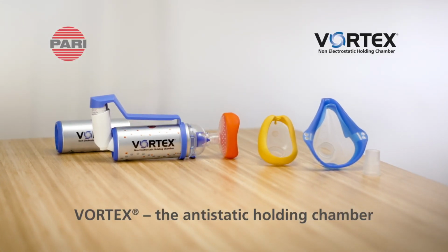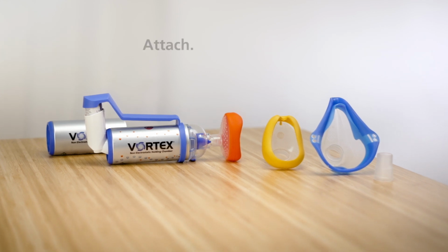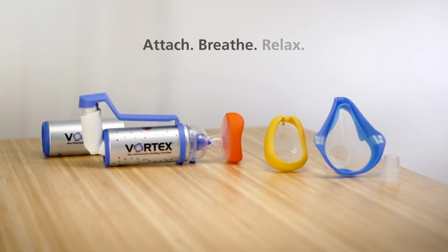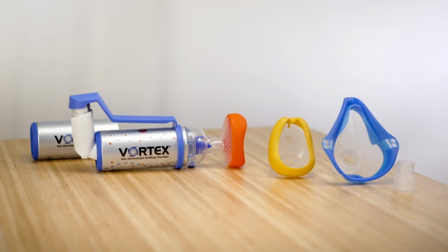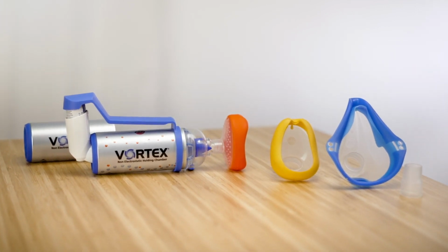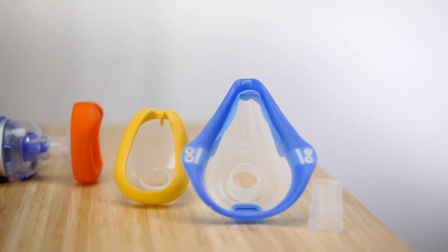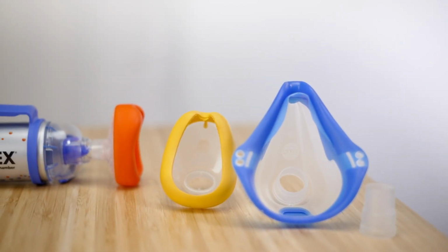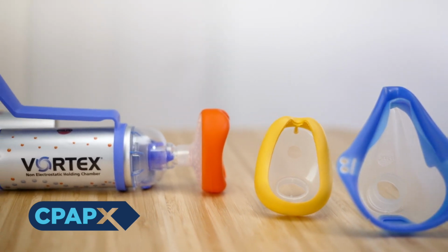Vortex, the anti-static holding chamber, so that the active substance reaches where it's needed. To make sure that it's used safely, we recommend that you clean the vortex and accessories after each use and disinfect them at least once per week. In the event of a severe infection, you're advised to disinfect once a day.